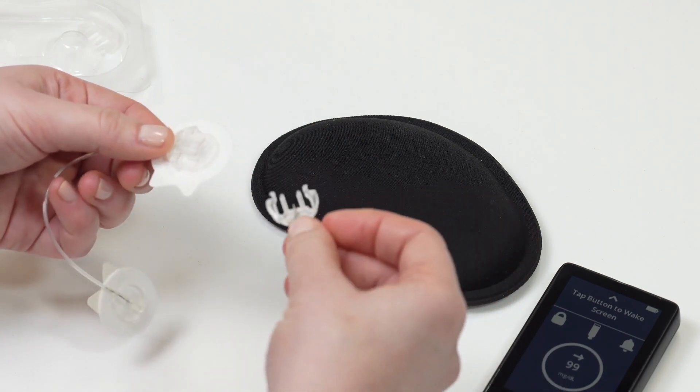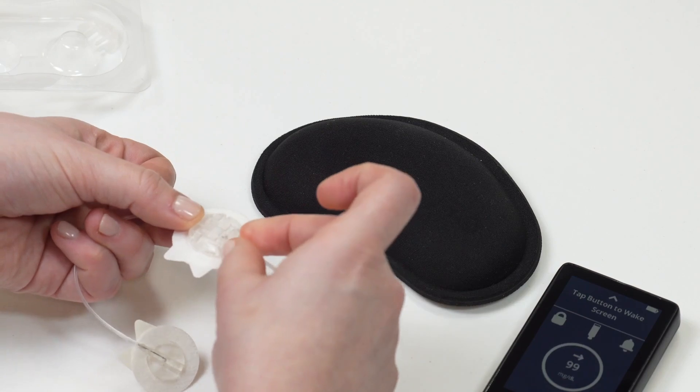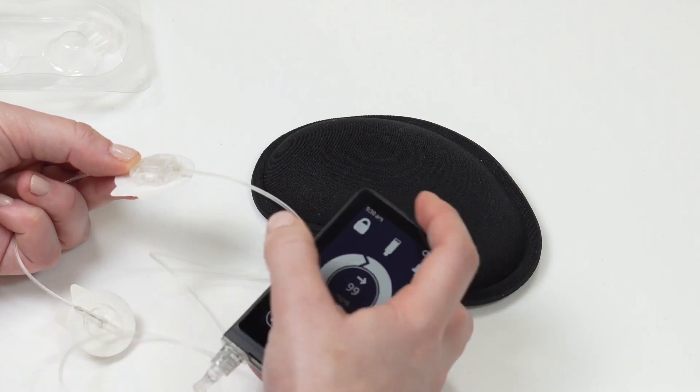Now you need to prime the short tubing in your new infusion set. Do not insert your infusion set yet. You must be disconnected from your infusion set before you fill the tubing.